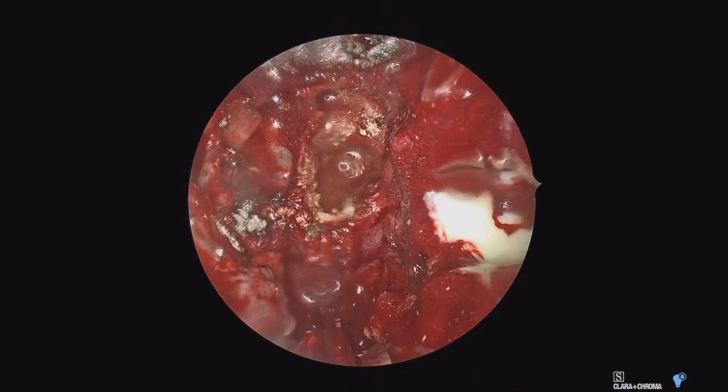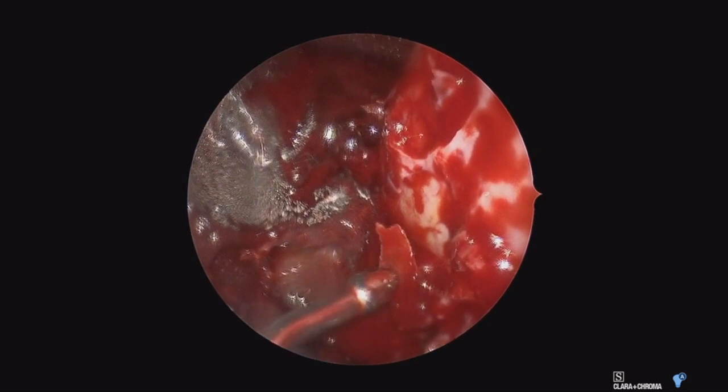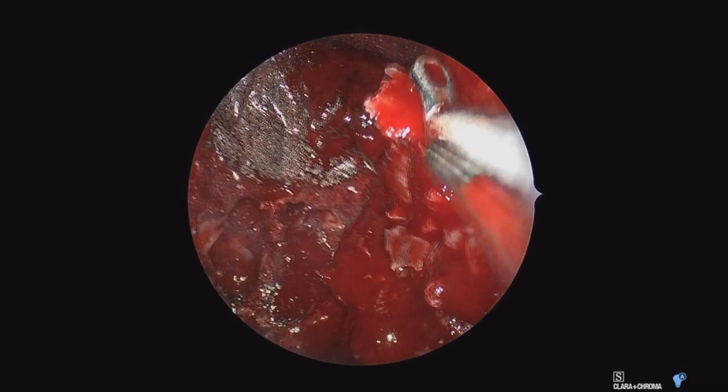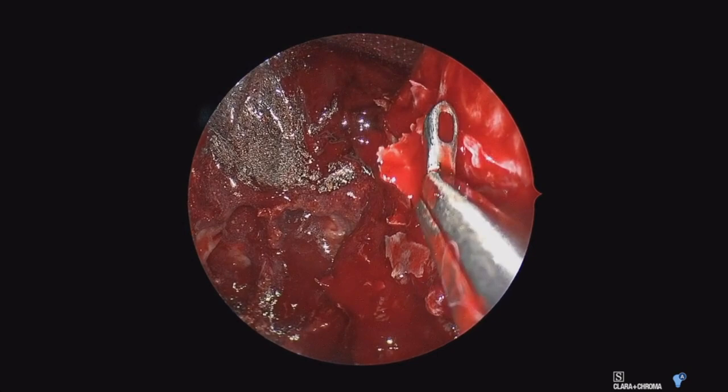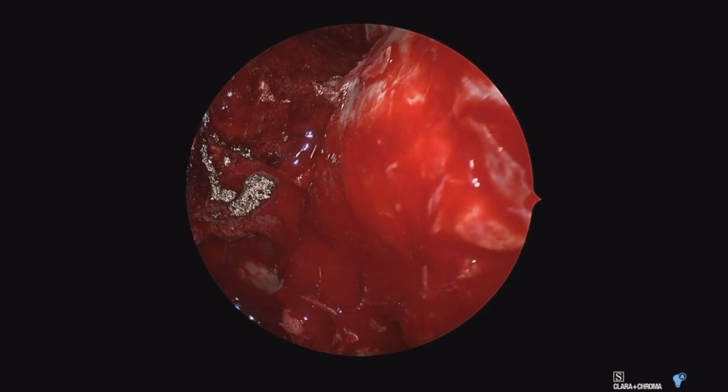Looking at the nasal cavity now, you'll see a much wider view with the septum and cranial base gone. I'm taking down the lamina papyracea to expose the periorbita. On the patient's preoperative scans, the tumor abutted the orbit in this area with no clear intraorbital extension. In these cases, I typically remove the entirety of the lamina papyracea and then remove and sample the periorbita itself to see if it's involved. If it is involved, we may resect the entirety of it; if it's clean, we'll leave the remaining periorbita in place.